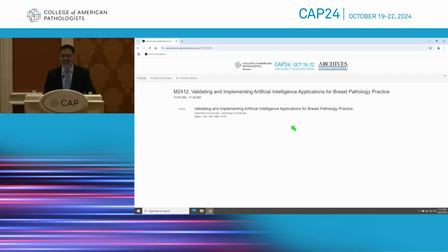Yeah, exactly. Especially for HER2 low and ultra low, the interobserver variability is huge. Even among experienced, subspecialized pathologists, we did a study and found huge interobserver variability among those pathologists. Definitely, AI digital image analysis can give you a more objective result.